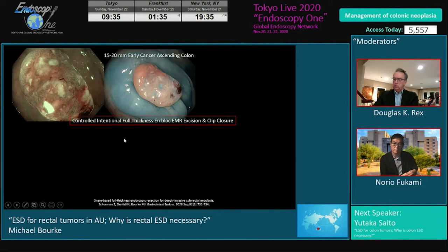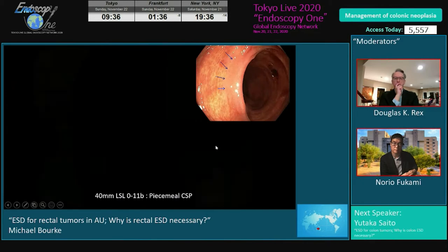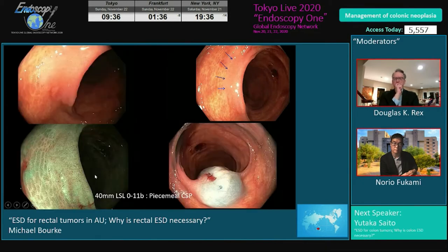We heard the excellent talk by Sergey Kanservoy earlier about full thickness resection. We have other modalities beyond the OVESCO system — snare-based intentional full thickness resection for early cancer in an older comorbid patient. We can deliberately take the muscle layer and then clip this, and you see the margin of resection. So for large flat lesions with no concern for invasive disease, piecemeal cold snare resection is an option.